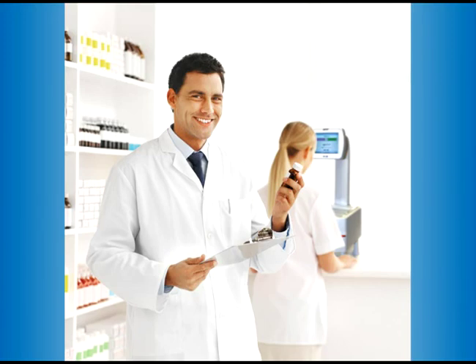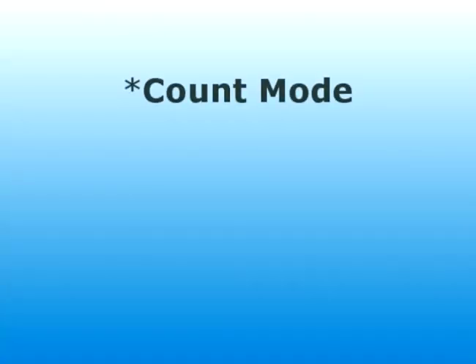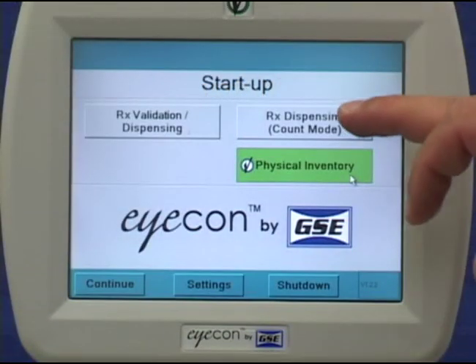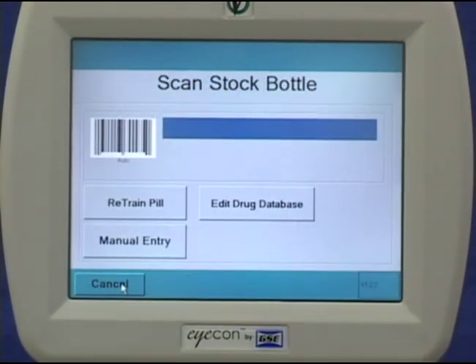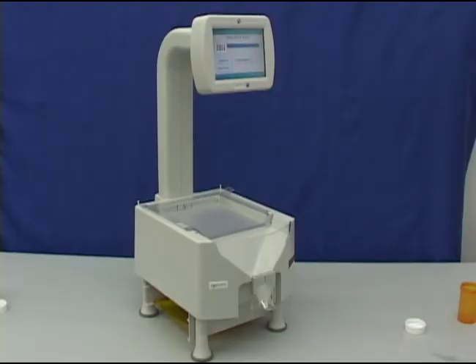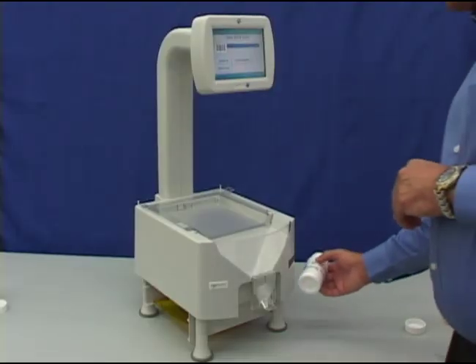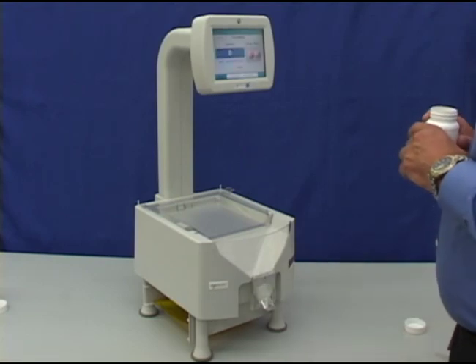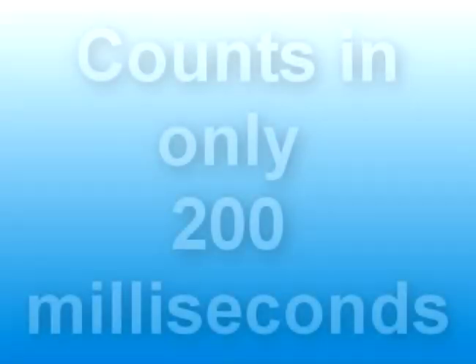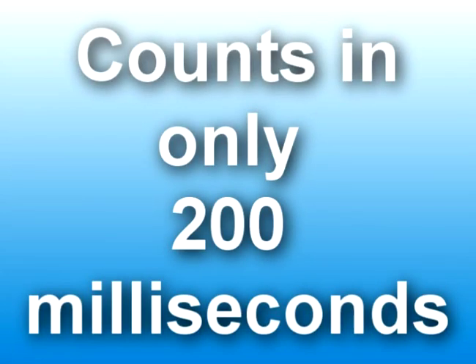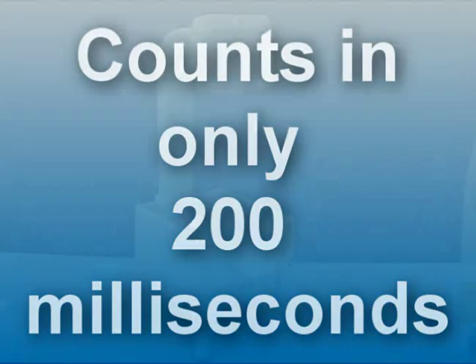Let's take a look at the three modes of operation in the ICON. First is the count mode. Be sure you're in the count mode by pressing the count mode button and then the continue button. Next, scan the stock bottle and pour the pills onto the counting platter. The ICON's vision system will count the pills in 200 milliseconds and display the count.